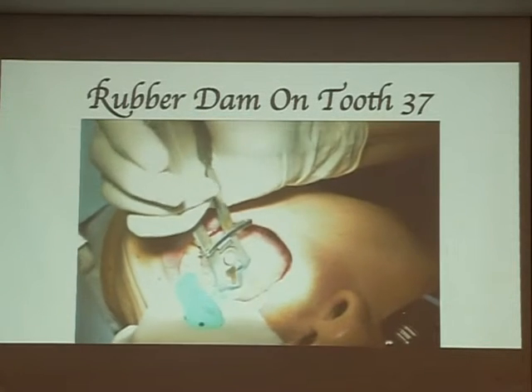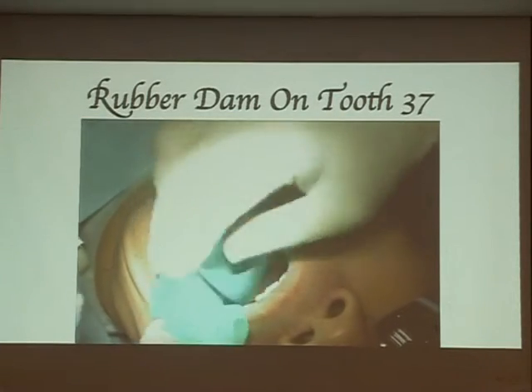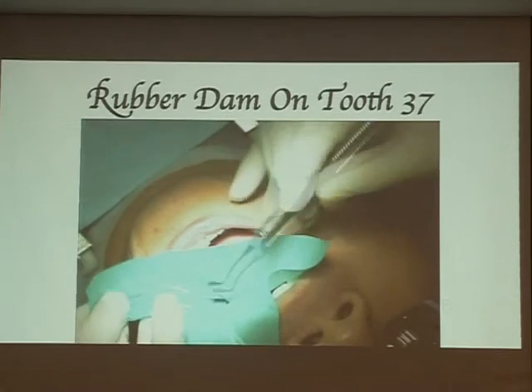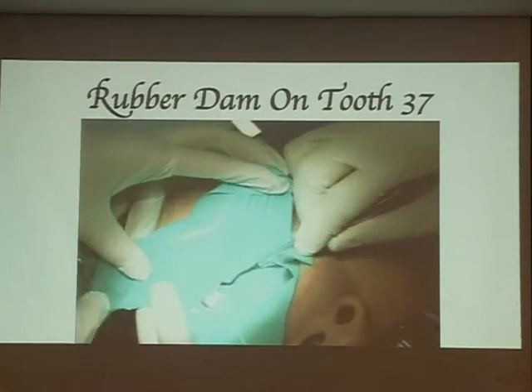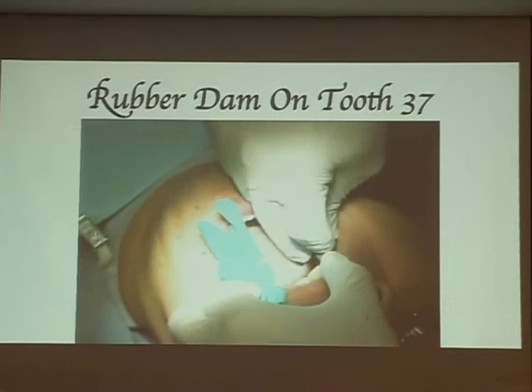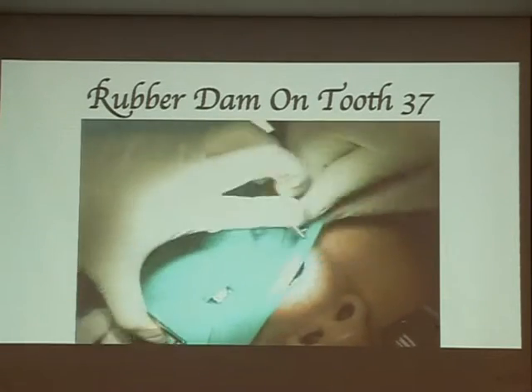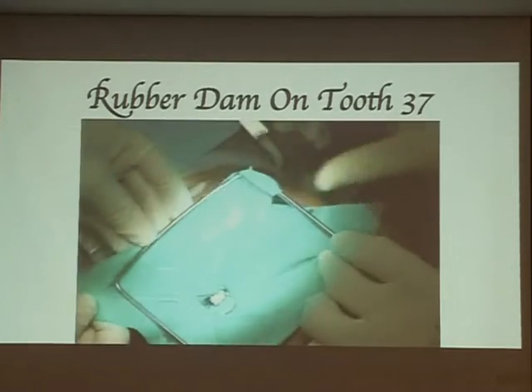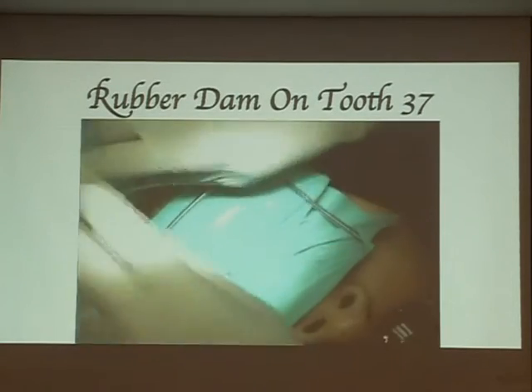Okay, this is a rubber dam demonstration. In one of my cases, I'm putting a rubber dam on a second molar or lower. For those who are watching the clock, we can use 20 to 40 seconds to finish the application. So I don't think time is an issue for single tooth isolation with a rubber dam. Material cost is very cheap. Okay, a rubber dam doesn't cost much.